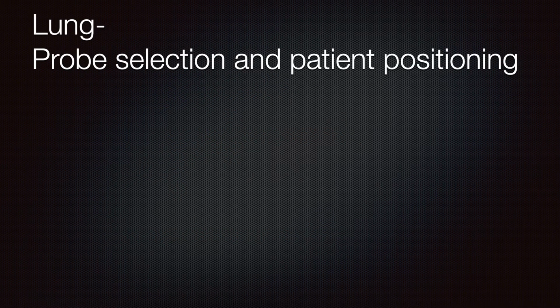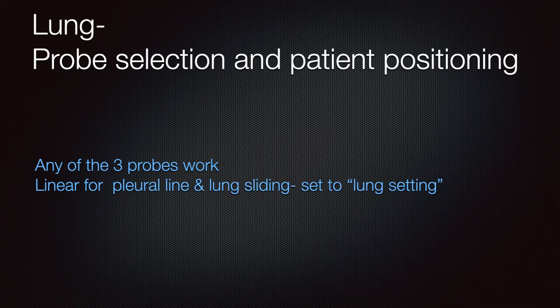So next we're going to talk about probe selection and proper patient positioning. And in honesty, all 3 of the probes do work, but I think generally speaking, people are going to prefer that the linear probe be used for lung sliding and to look at the pleura closely. And sometimes the lung setting itself is better to do this and look at A lines.